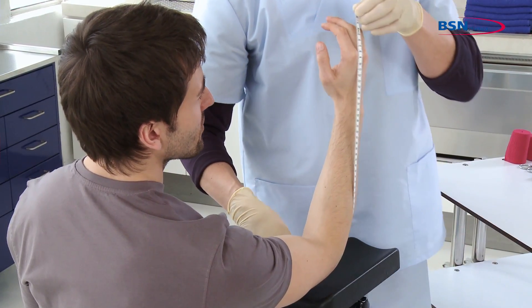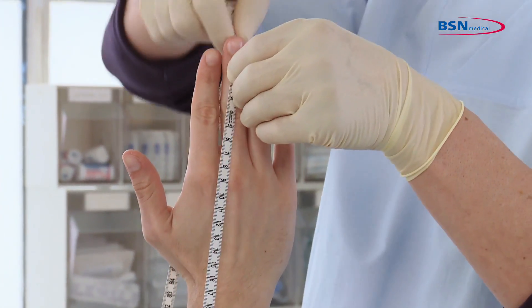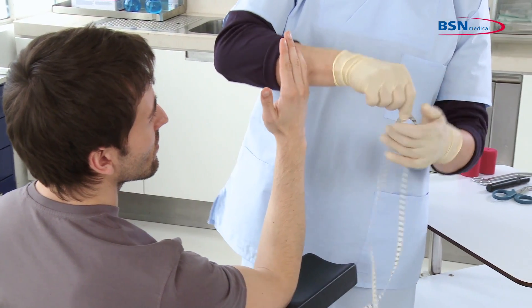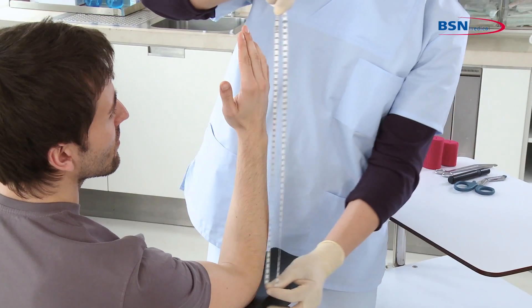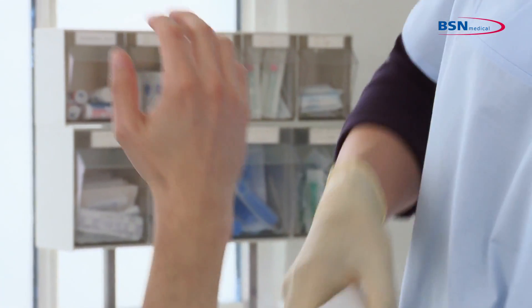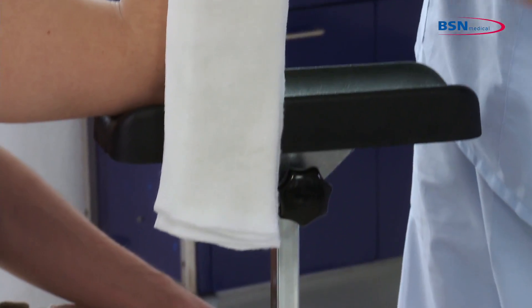To start, measure from behind the elbow coming up both sides of the arm to the highest tip of the fingers. Then cut the desired length of the splint. The overlapping part of the splint provides elbow protection.